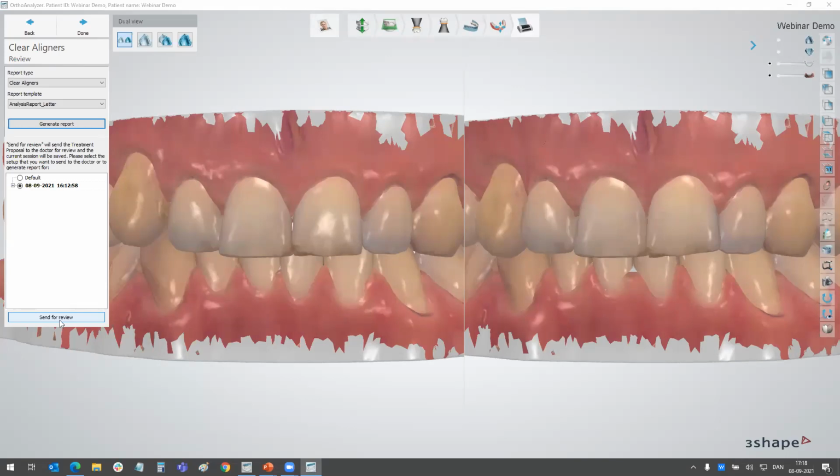We have a question here. When you select export in the background and want to start working on a second case, do you require additional client points on your dongle? And no, you do not. It will not lock client points regardless of how many export in the background sessions you have running. It's only the active design session that would require a client point.